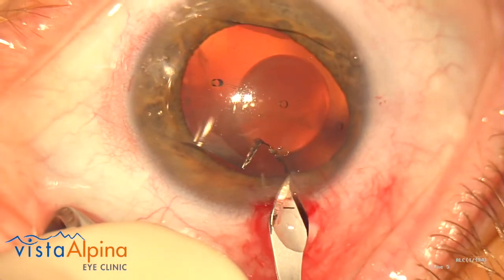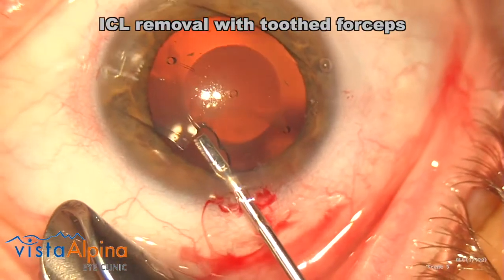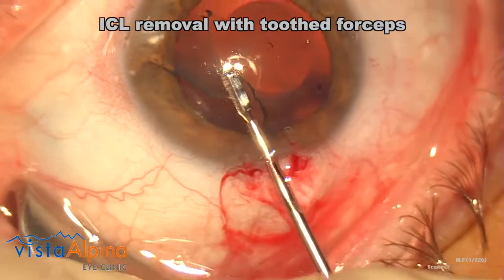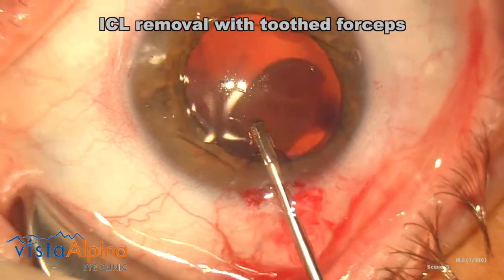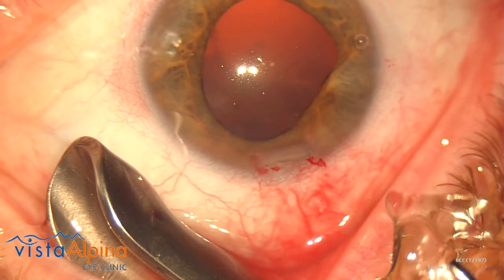Which of course is still not bad given the fact that we were dealing here with the largest ICL size of 13.7 mm. The ICL is very thin and floppy and will always allow for safe removal as long as you use enough OVD.